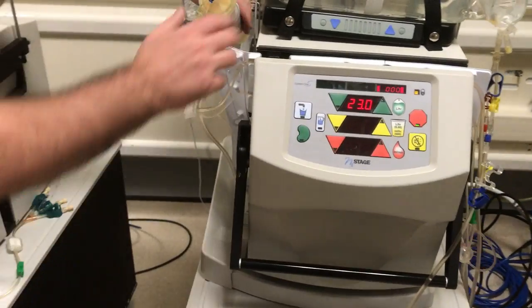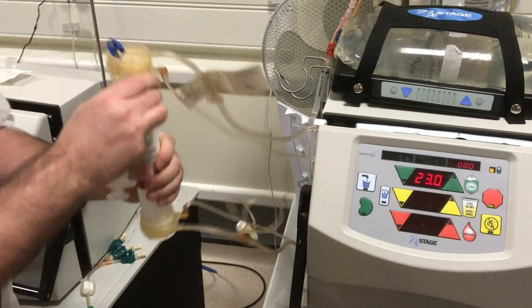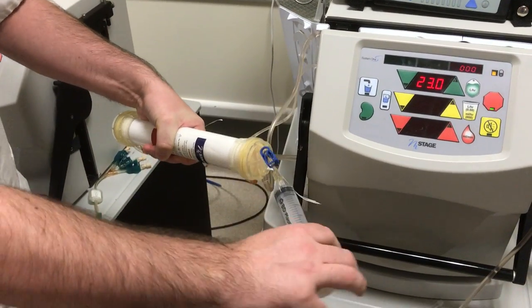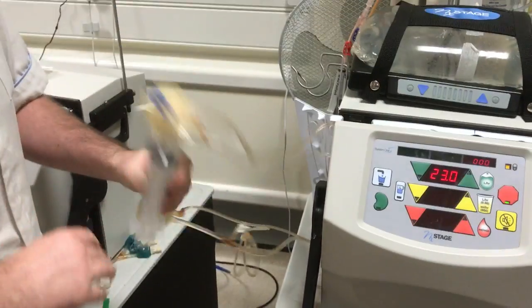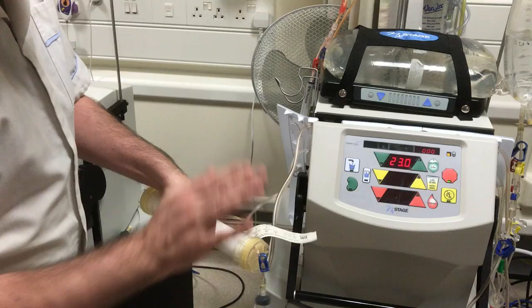Then we go over to the machine on the other side where the dialyser is. Take the dialyser out of the holder and turn it down, with the blue end at the three o'clock position, and give it one, two, three pats. Then up: one, two, three. Then again.